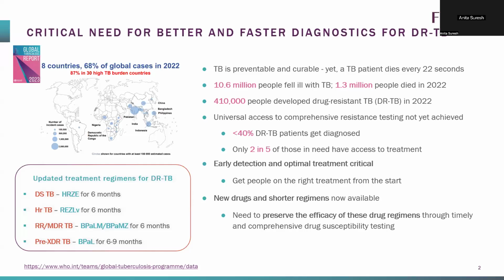But this means we definitely need ways to do comprehensive drug resistance testing, because you want to make sure we're not only protecting the patients, but also protecting the efficacy of these drug regimens so that they can be used for longer. For anyone familiar with AMR, of course, resistance is inevitable. You just want to delay it as much as possible, with judicious use of drugs directed with diagnostics, so that the patients are getting the right treatment at the right time, and we are not going through a series of treatments trying to play around with what works and what doesn't, unfortunately.